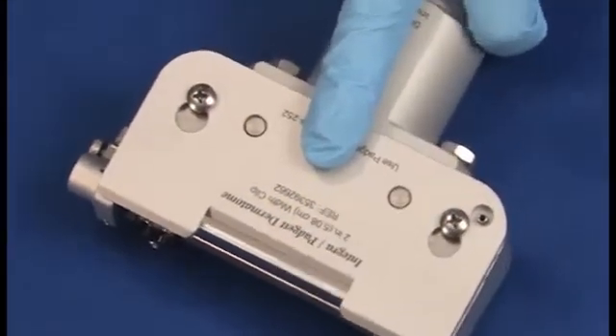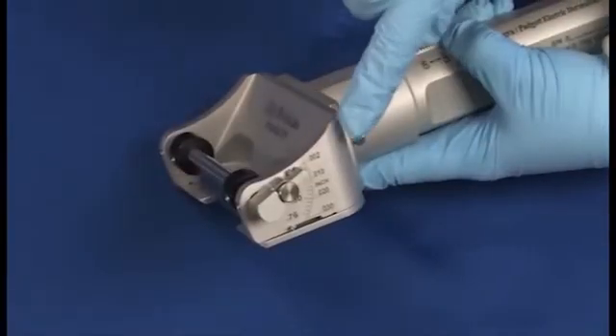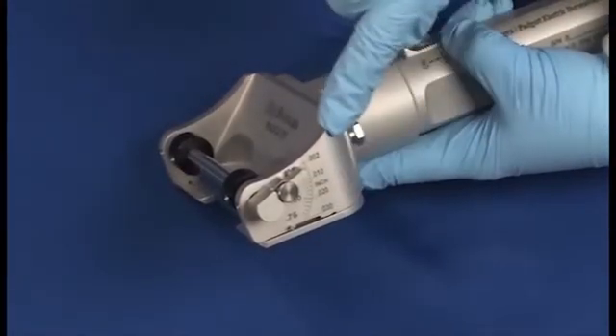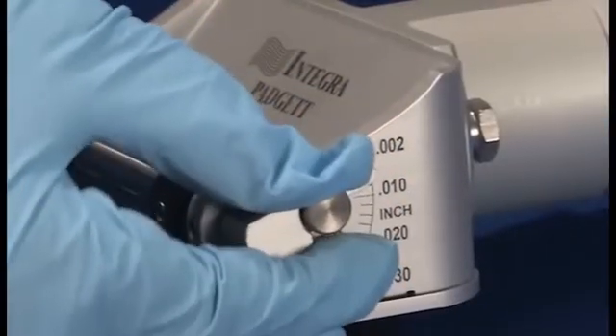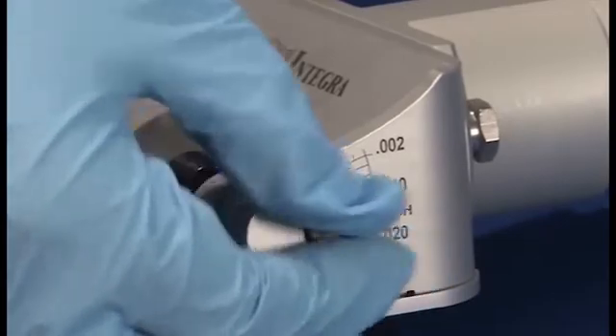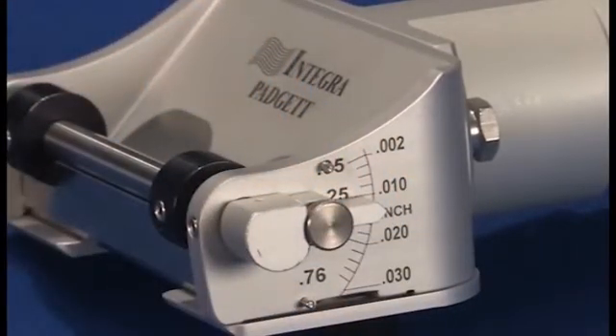The thickness of the graft is determined by the surgeon using the calibrated scale on the head of the electric dermatome. To adjust, first loosen the screw on the scale, then move the scale to the desired thickness and re-tighten the screw. Be sure to loosen the thumbscrew prior to rotating the knob to a new thickness setting. Note that the actual thickness of the graft taken is largely dependent upon surgical technique and may vary from user to user.